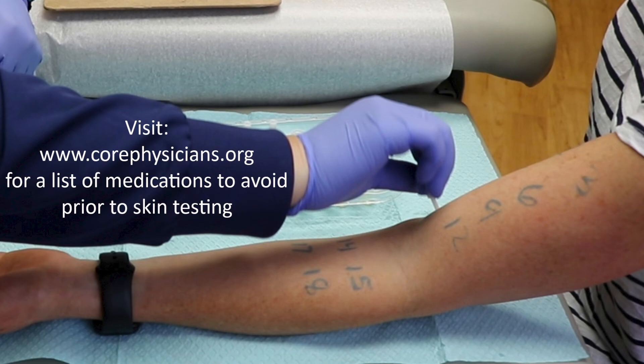Skin tests are usually more sensitive for screening for most types of allergies compared to blood tests. Certain medications may prevent skin tests from reacting. Please check our website, corephysicians.org, to see the list of medications that should be avoided before skin testing.